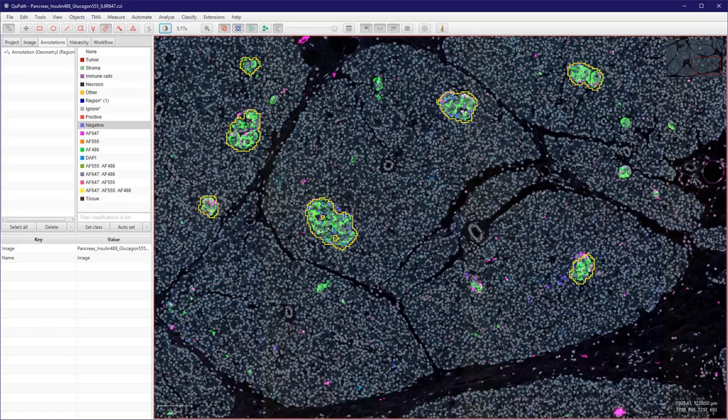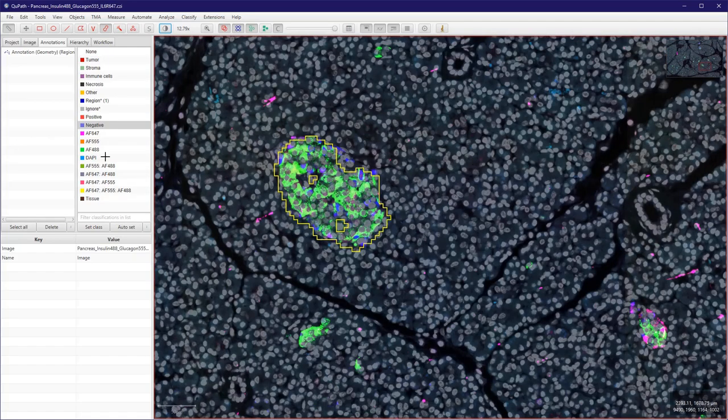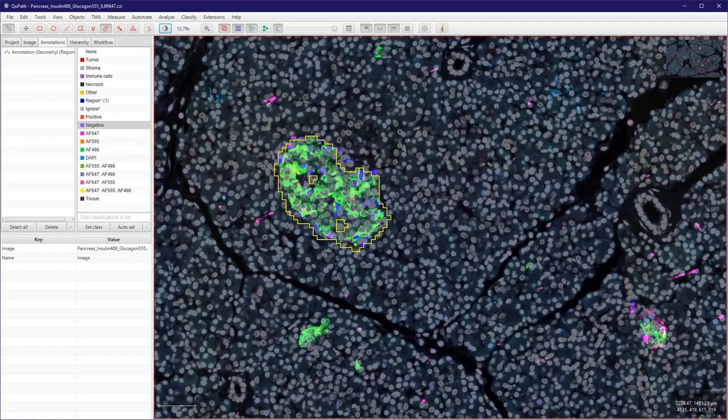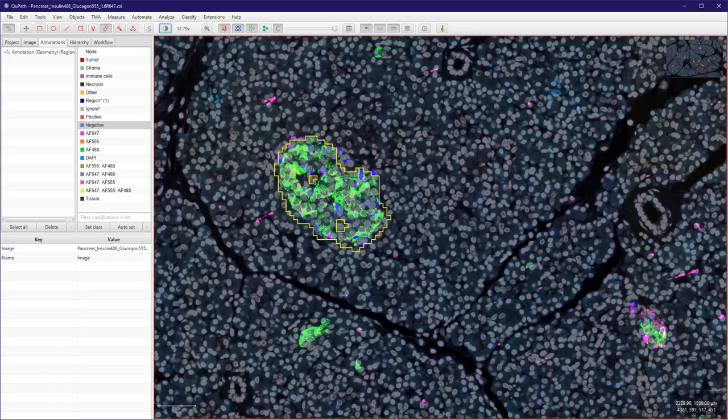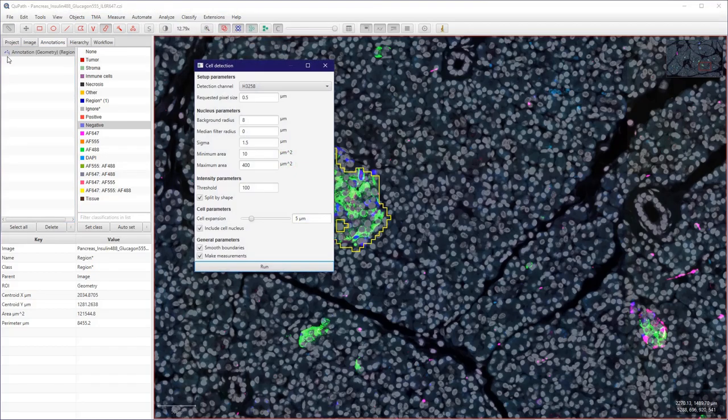The next step is to do some cell detection since we have some cells inside this image. So let's just do this quickly. So from this annotation we go to Analyze, Cell Detection, and use the cell detection tool here.